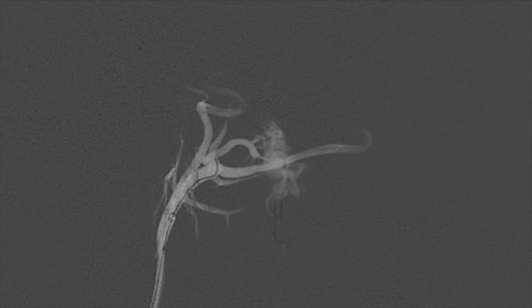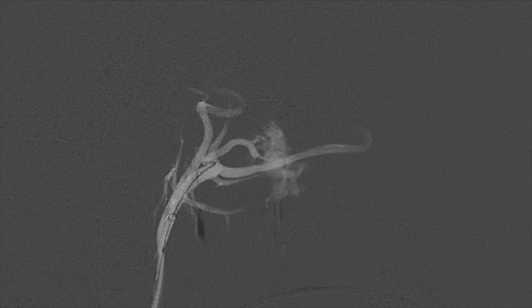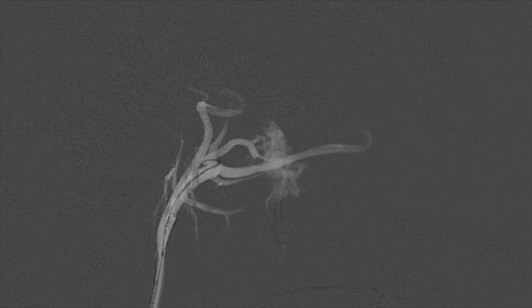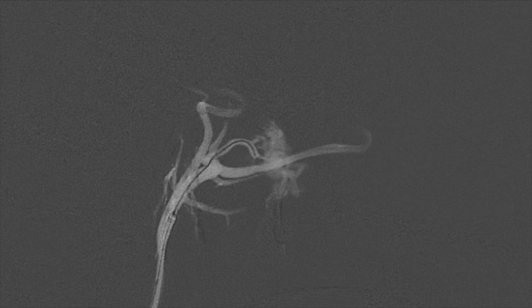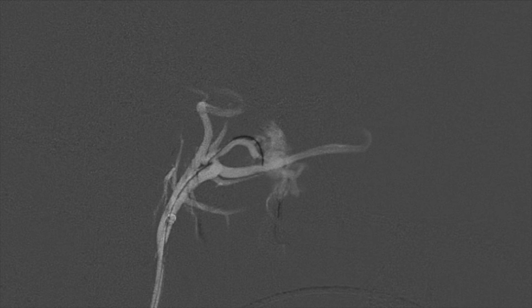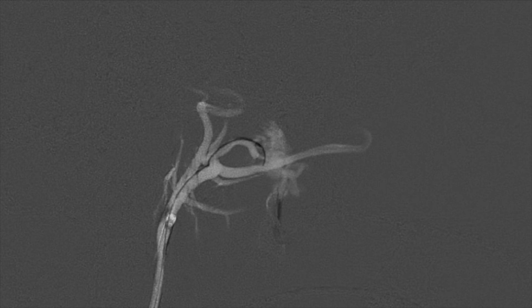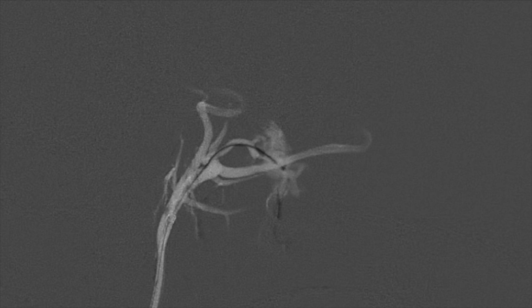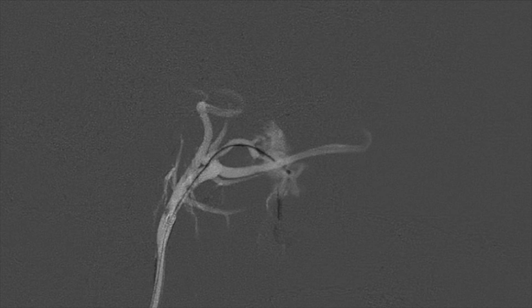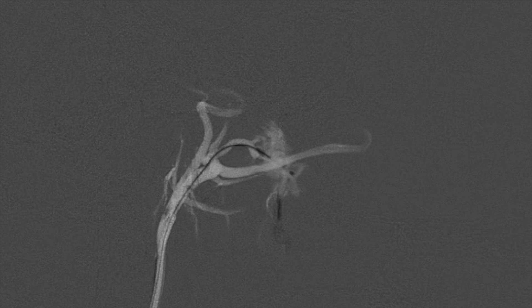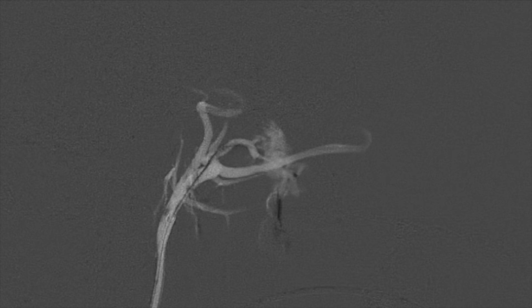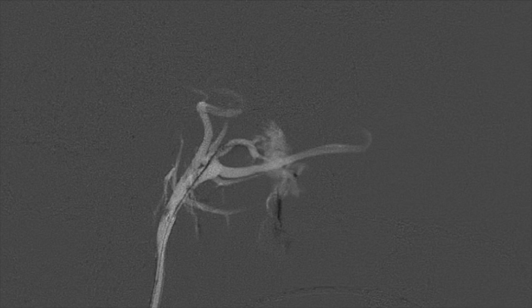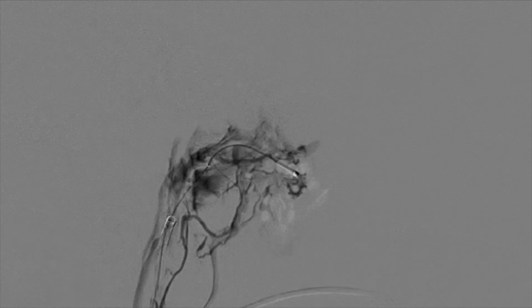Once we were able to select the artery with the guide wire, we slowly advanced the Echelon 10 microcatheter into the feeding artery. We were able to catheterize the arteriovenous connection itself and place the microcatheter directly into the pterygoid venous plexus. Following successful positioning of the microcatheter, we performed an angiogram to confirm appropriate positioning, which demonstrated our microcatheter clearly within the pterygoid venous plexus.